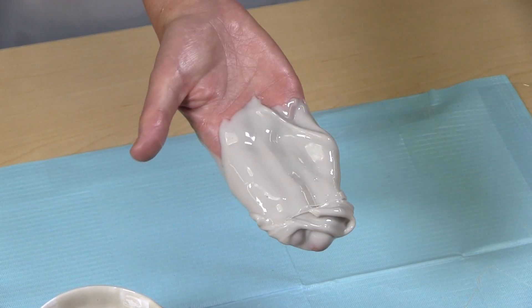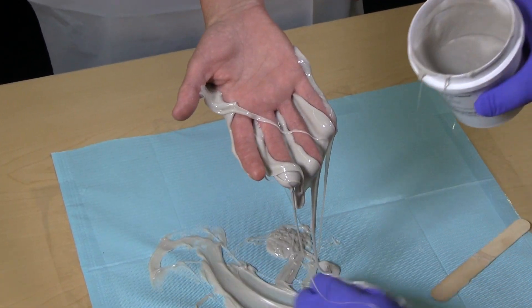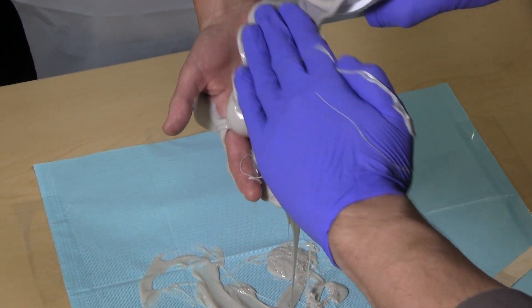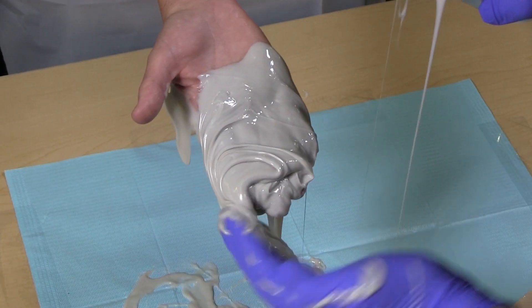A common error is to leave the impression too short. Excess material can be scooped off of the work mat and applied to the hand to fill in any holes or gaps that may appear. Try not to let any holes or thin spots appear.